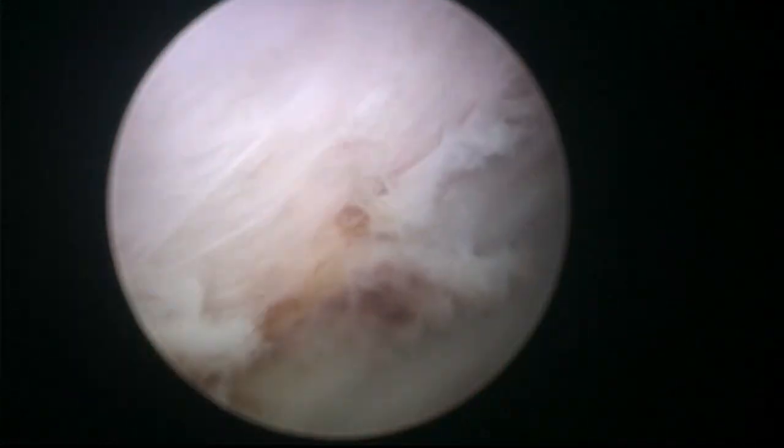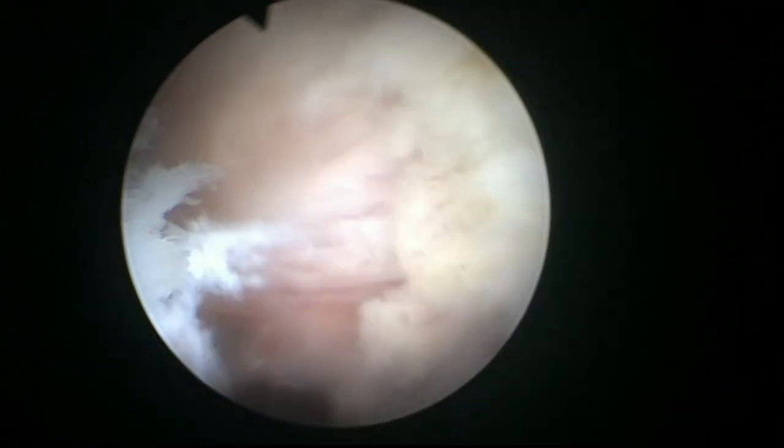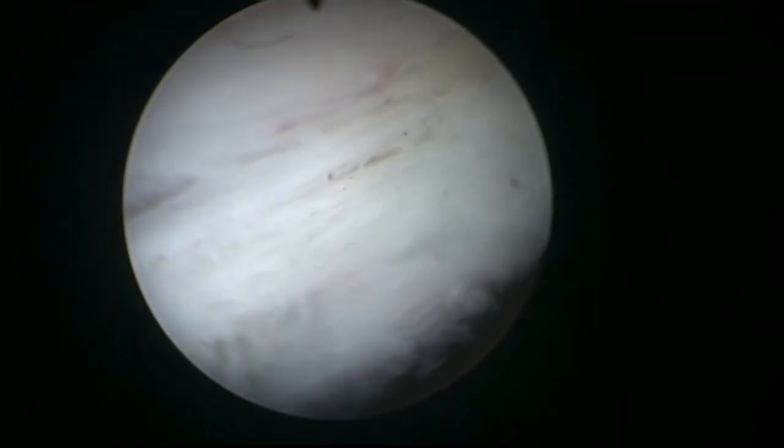Okay, so we're going to get ready. This 24 French endoscope allows me to use the morcellator as well. Let's see if we see properly. Yes. Now I'll change the light and I will connect the water. This is a Richard Wolf endoscope, and it doesn't have the shark connectors. It's the old model, but in 24 French size, so more appropriate for patients with tighter urethras.